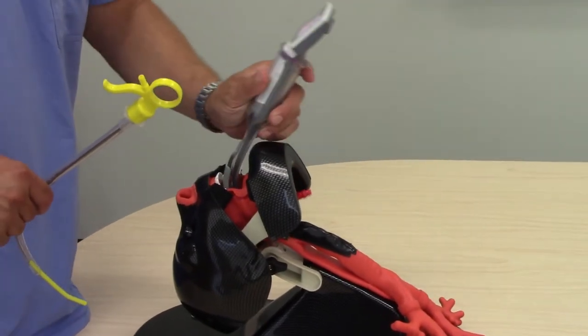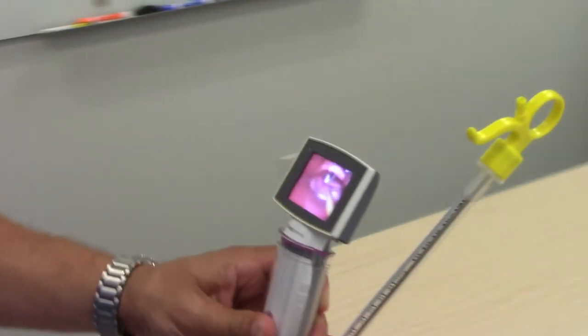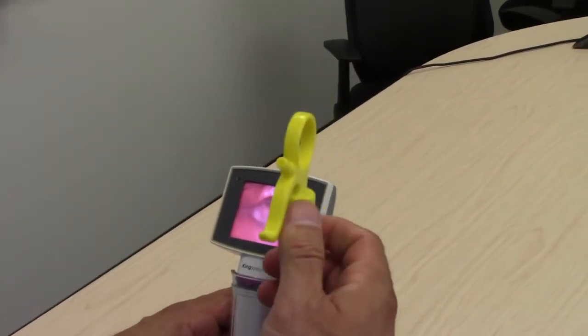During this mannequin demonstration, we can see how a single practitioner can easily and safely place an endotracheal tube using the J-WAND.